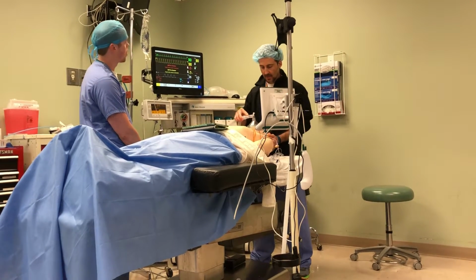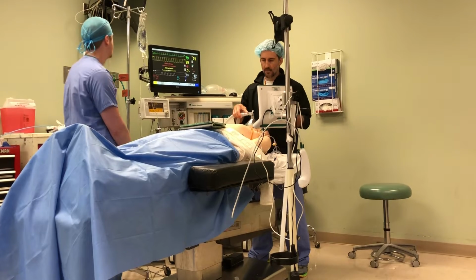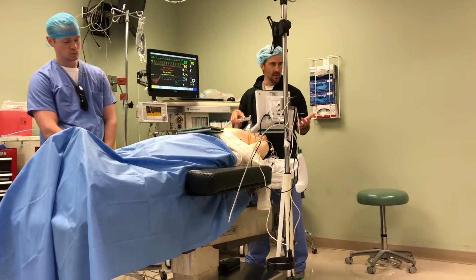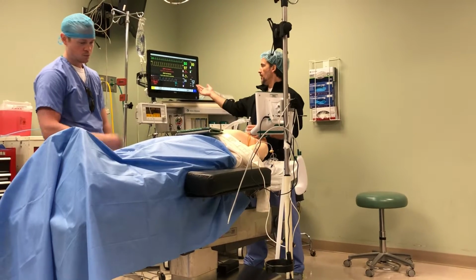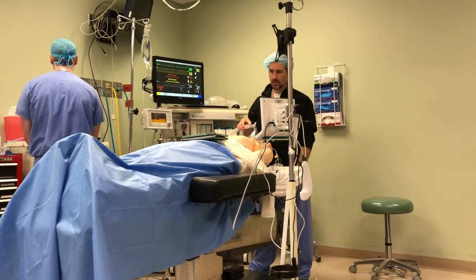All right, gonna have you take 3 really deep breaths for me, all the way to the bottom of your lungs. Also, if you can't do that, I'm verbalizing. I want 3 minutes, 100% FiO2, and I want end tidal O2 85 or greater. Those are my 3 parameters I'm looking for.